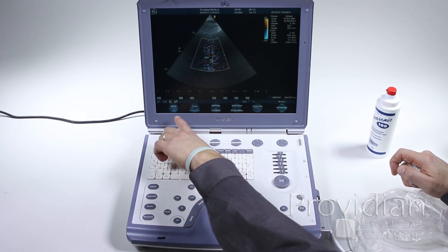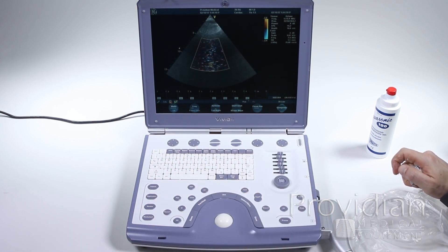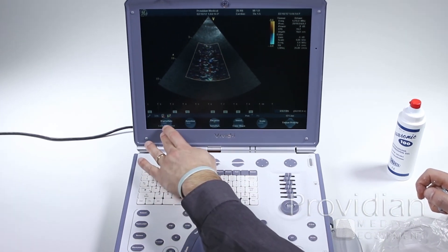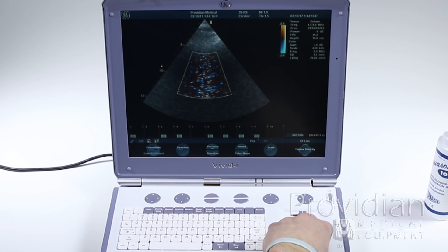So notice when I do that, these controls along the bottom also change. So now it's saying I can change that 2D image. If I click on active mode again, now I can do these things to change that color image.